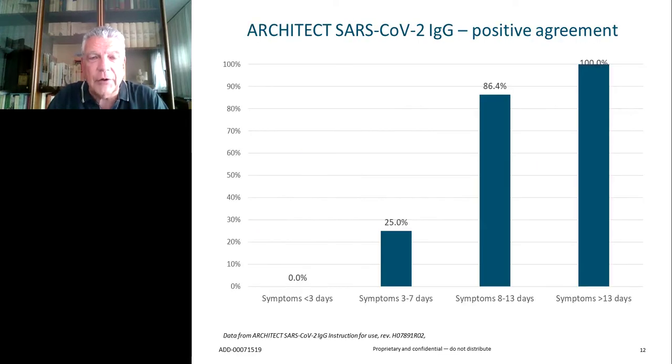The other issue, of course, is establishing the positive agreement or sensitivity, if you wish, of any given assay. In the case of the SARS-CoV-2 IgG assay, this has been done in the validation by taking a cohort of patients that have been tested in a very early phase or a little bit later, so until 2 weeks after the onset, and then after 2 weeks or more. The data you will find in the insert give these figures, but those figures do come with a confidence interval because, as you know very well, 100% will never exist in medicine or in biology. So everything should be framed into a very specific confidence interval.